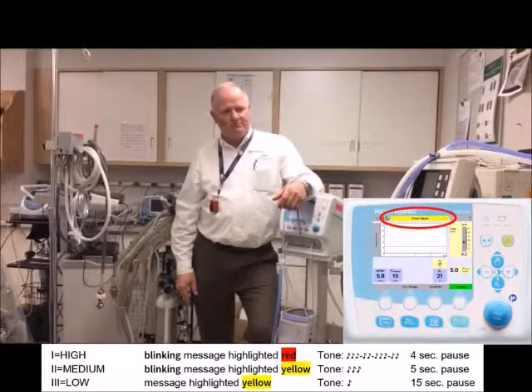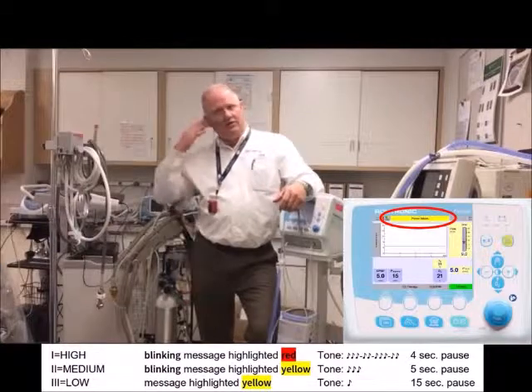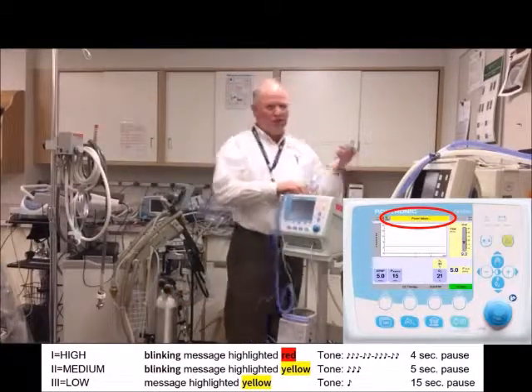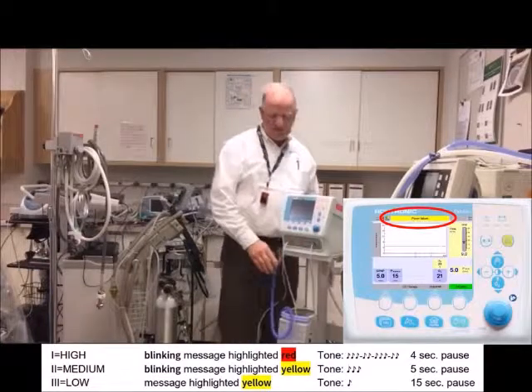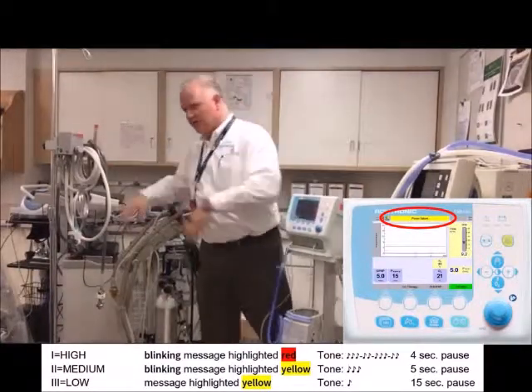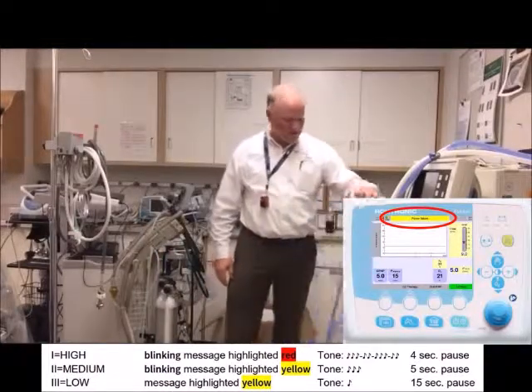The alarm system tries to communicate urgency. If you're working at another baby and see an occasional beep, you know you can finish what you're doing first. But if it's all freaking out with rapid beeping, you better go check — there might be a disconnect or something serious going on.